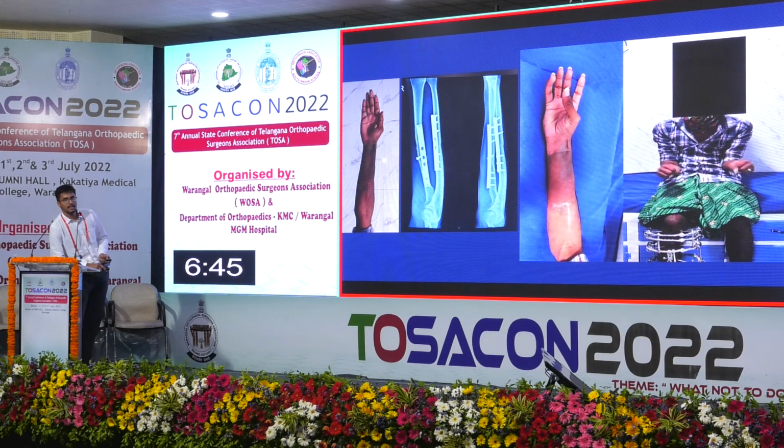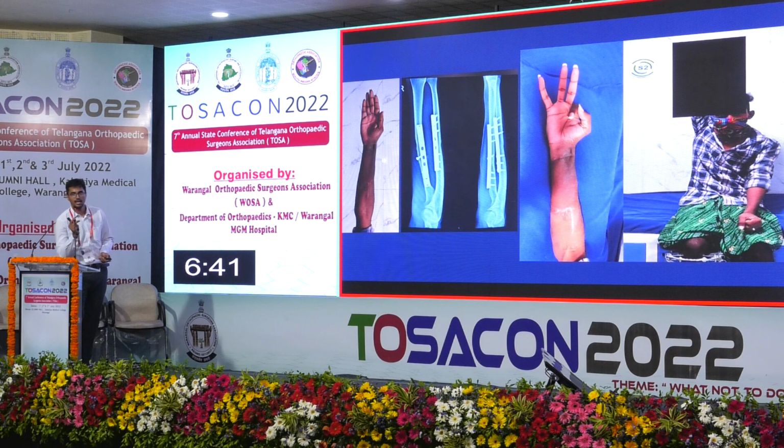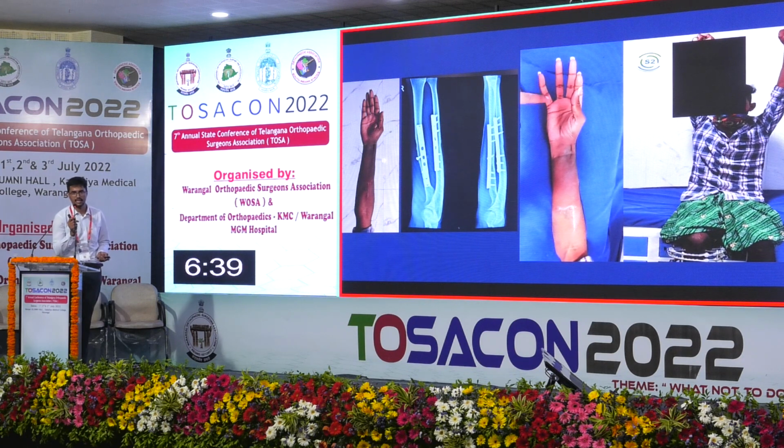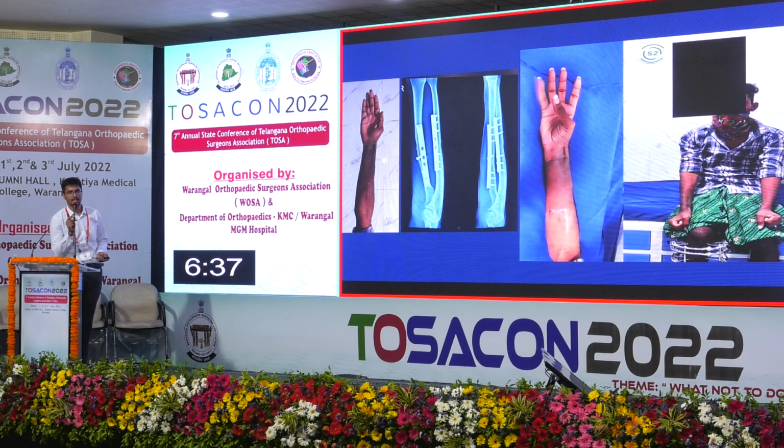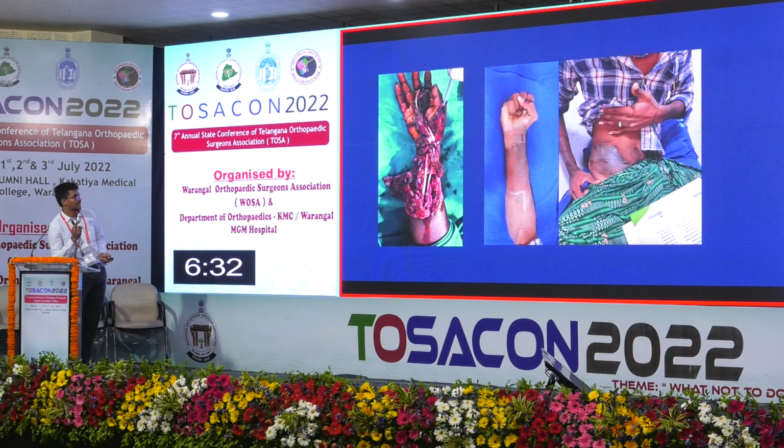So the key is to debride it properly, do a good stable fixation, early mobilization is the important thing, and early immediate flap cover to cover the defect. So this is the final result, and this is the donor site wound.